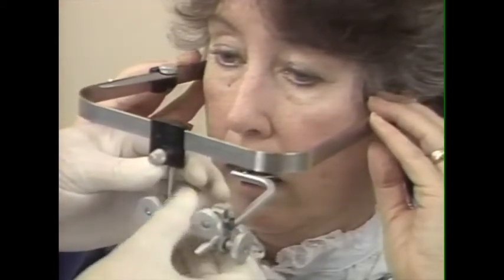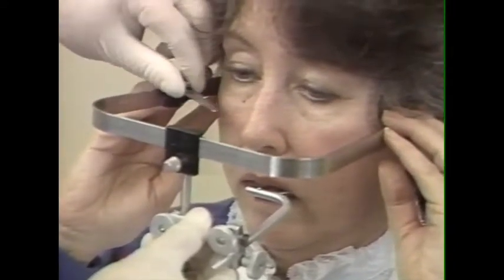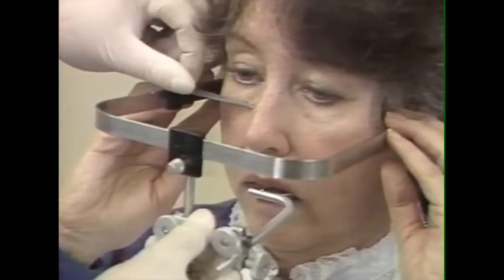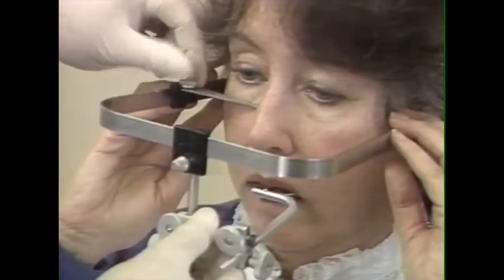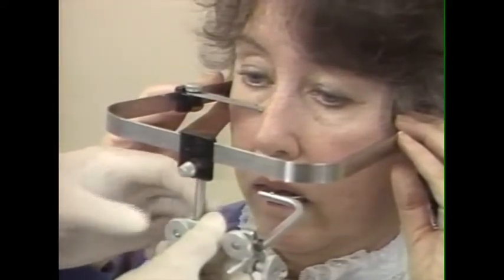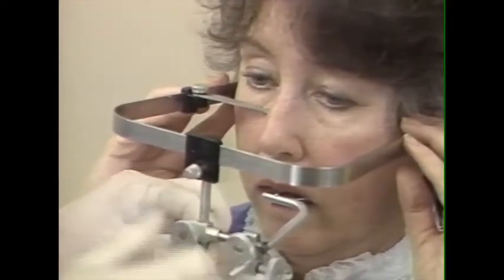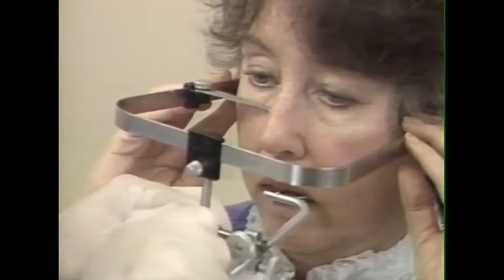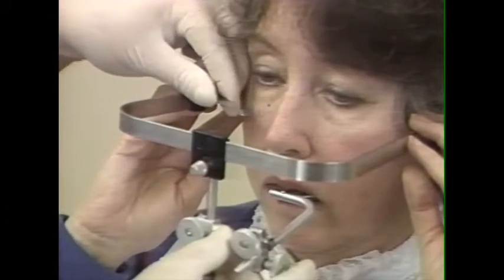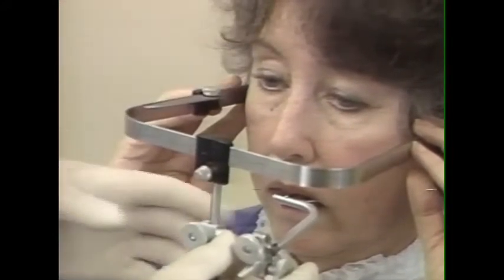And then we elevate and lower the face bow until we can orient the infraorbital pointer to the axis orbital plane, which is a plane running through the 2 hinge axes and the infraorbital rim. We then need to tighten this number 1 screw at the proper level. Tighten it securely so that it won't slip. We're now finished with the infraorbital pointer, and we can move it back out of the way.